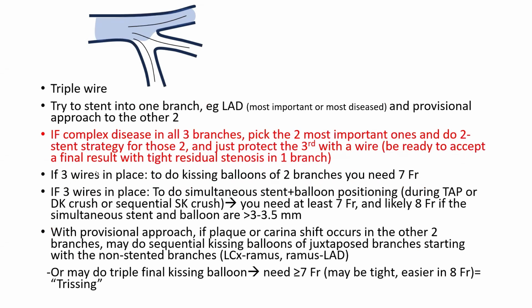And keep in mind additional technical ideas. If you have three wires in place, in order for you to do kissing balloon, to place two balloons while you have three wires, you need a 7 French guide.